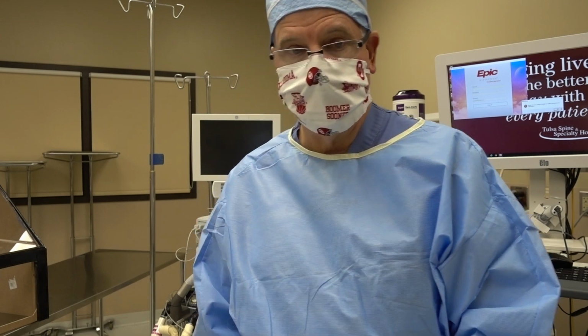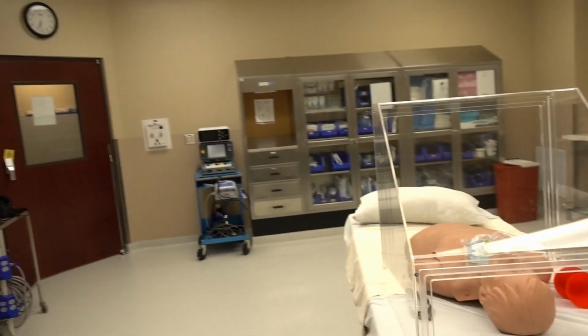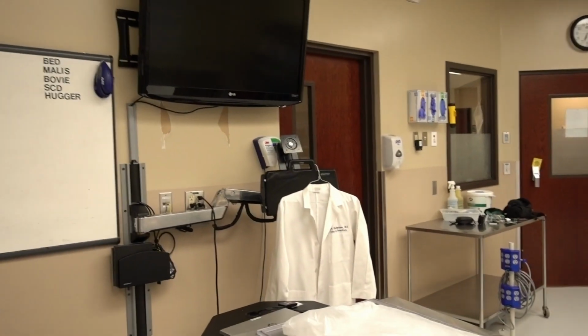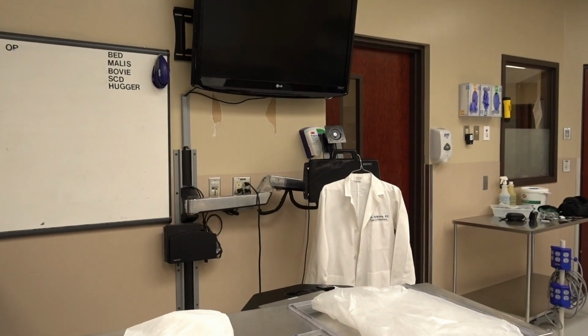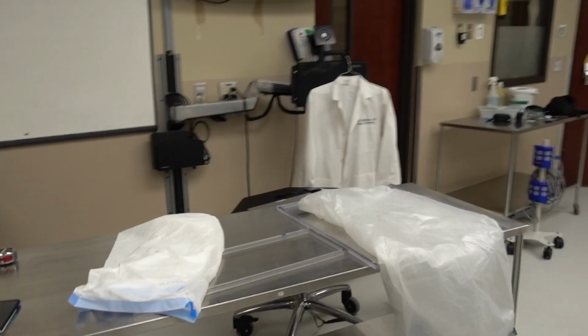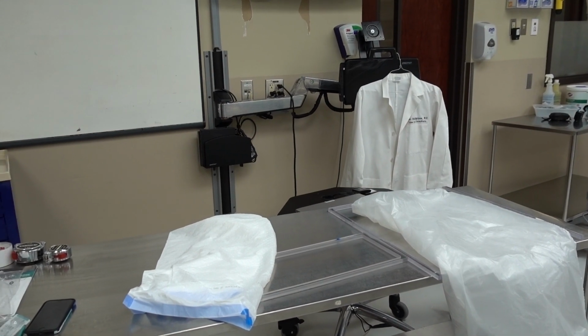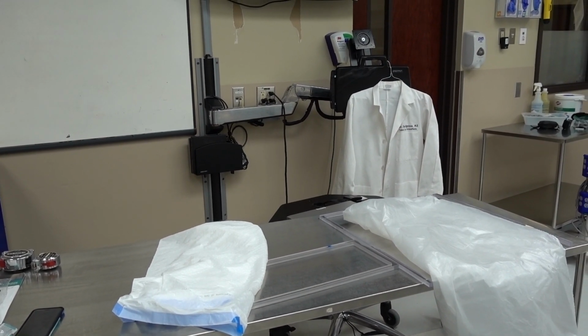And we're going to flip the camera around here. I'm here at night alone doing this, so it may be rough, but we'll get through it. So there's our bags and our retaining rings. The retaining rings are actually made of polycarbonate. The rest of the stuff is acrylic.